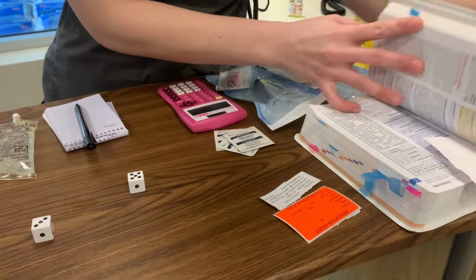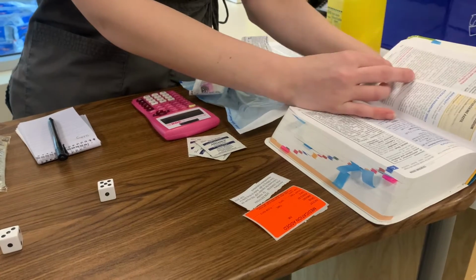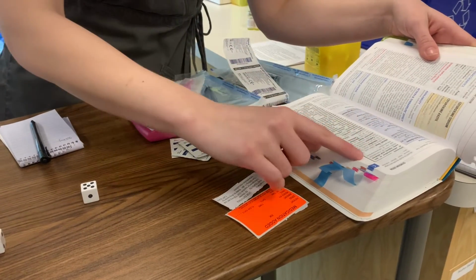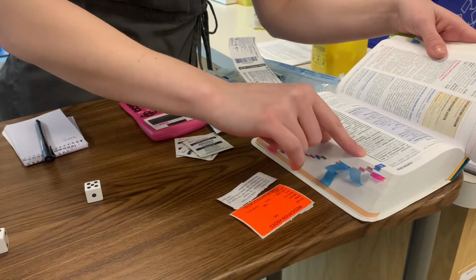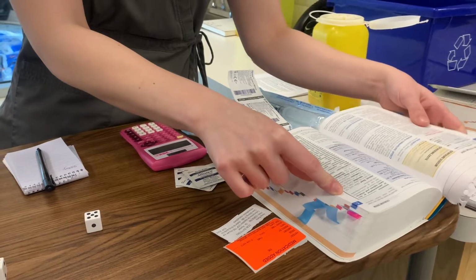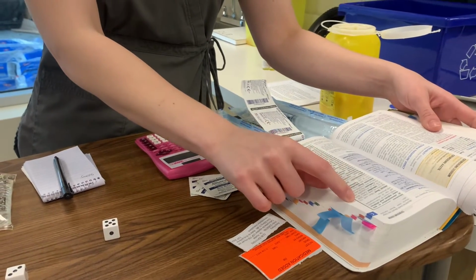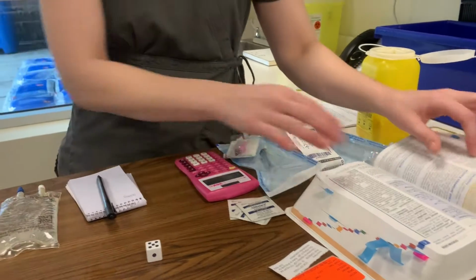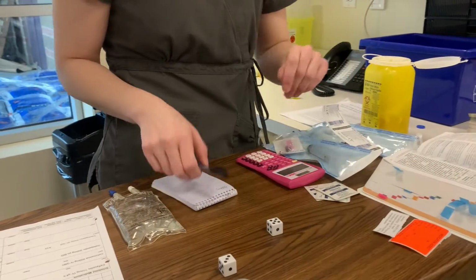And then when I open this book here, I'm going to find out what I need to reconstitute it with. It says with each 750 milligrams, it needs 8 milliliters of sterile water. And it says that it is okay to dilute into my solution here of the dextrose 5. Okay, so I'm going to start out.